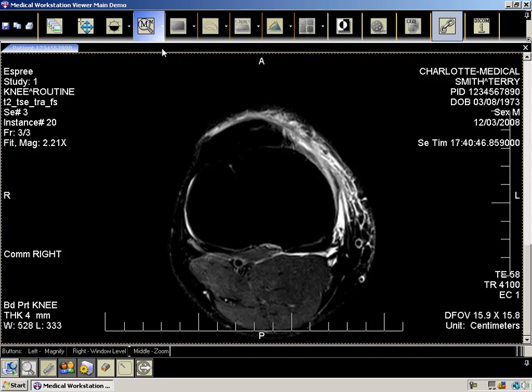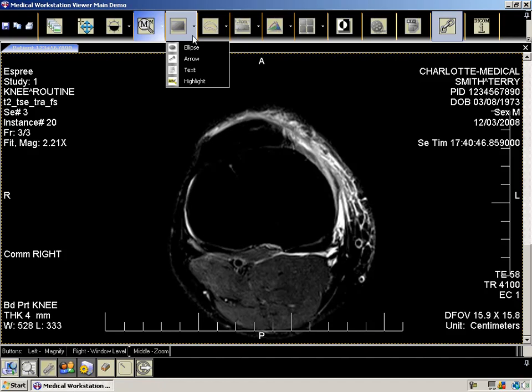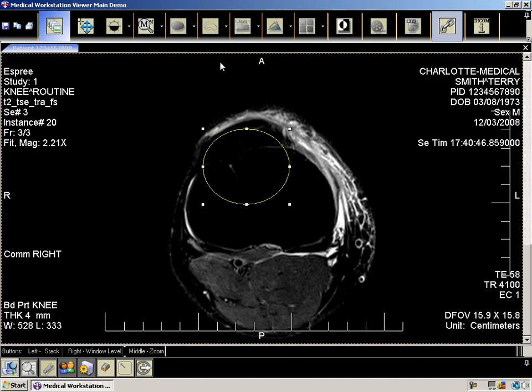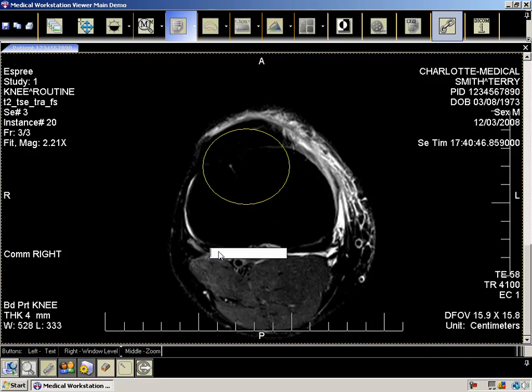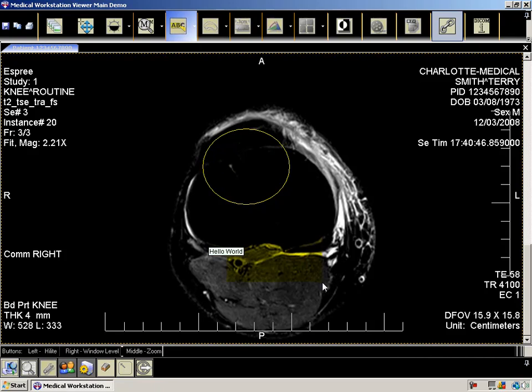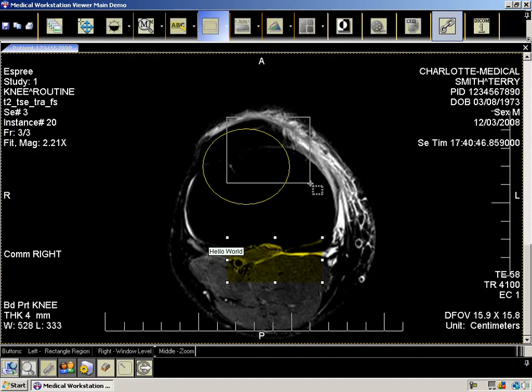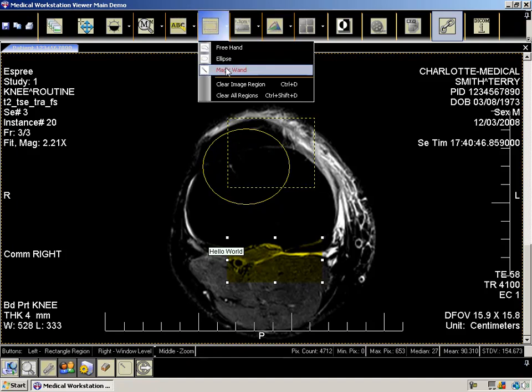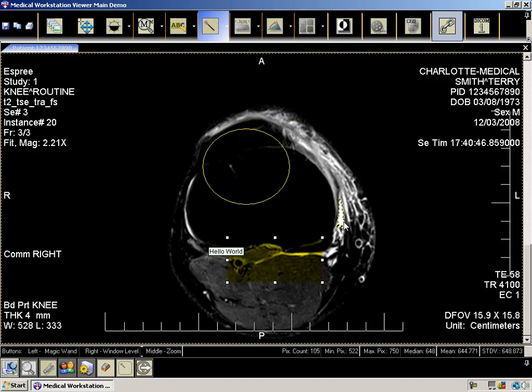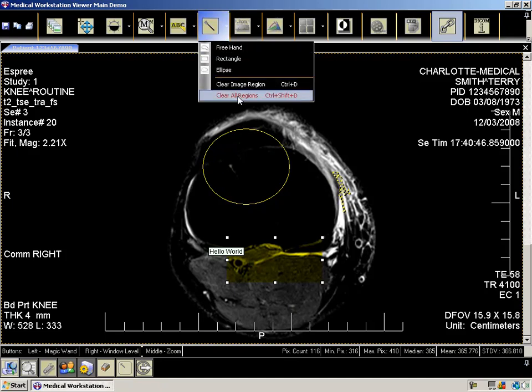The annotation button also contains a drop-down to allow you to select four types of annotations. The region button allows you to create four types of regions: a rectangle, ellipse, free hand, or you can use the magic wand. The magic wand allows you to create a region based on a color. You can also clear the region from the image or from all images.